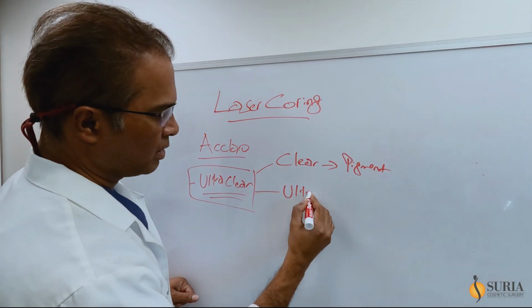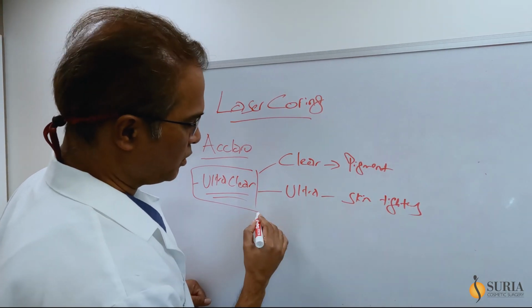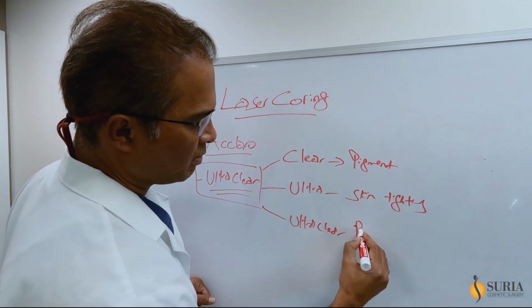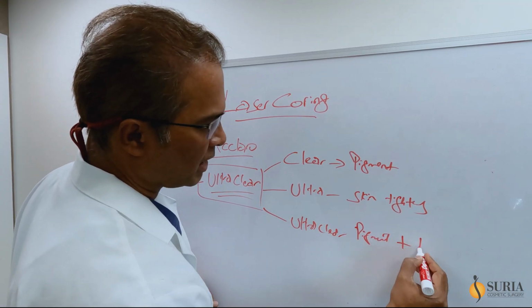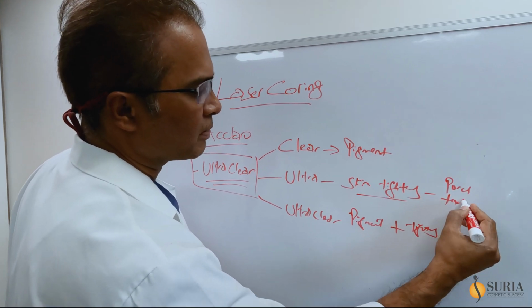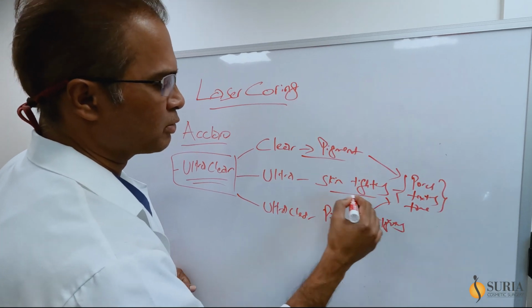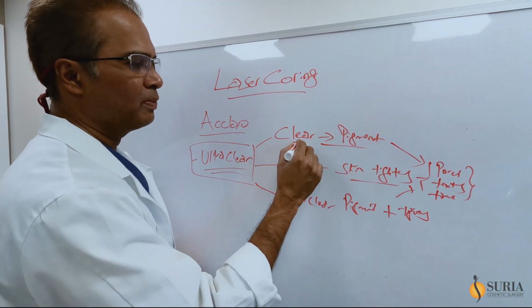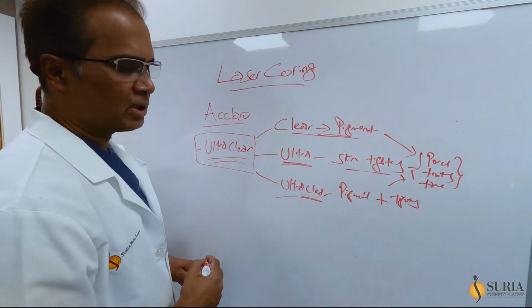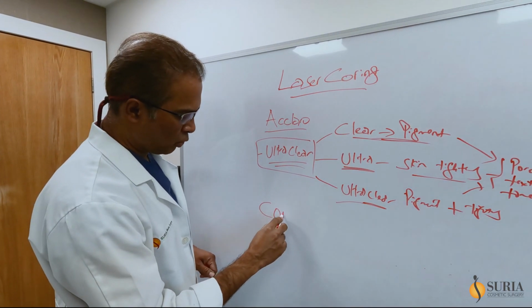There's ultra, which is for skin tightening perhaps. And then you can do ultra clear, which does both of these, pigment plus tightening. And skin tightening includes pores, texture, tone, all those things, right? Pigment also has some of these components, but essentially ultra is a bit deeper. The clear is a bit more shallow. The two of these combines these in one treatment, and you can do that, okay? So that's what I typically do, but the interesting thing I want to talk about is coring.